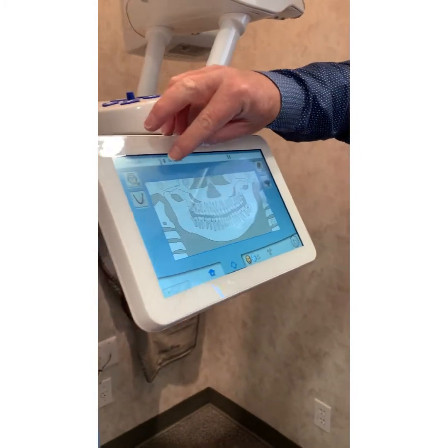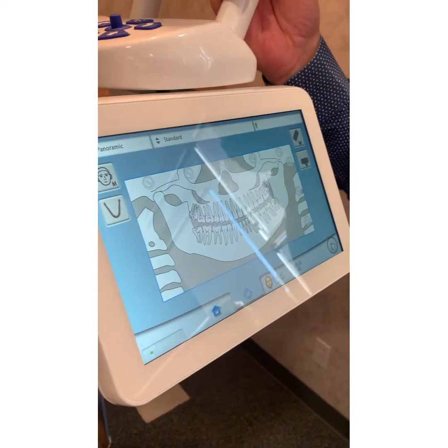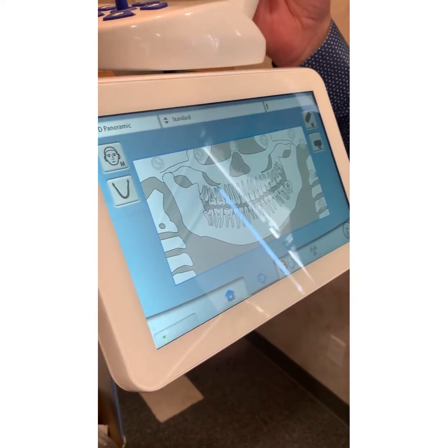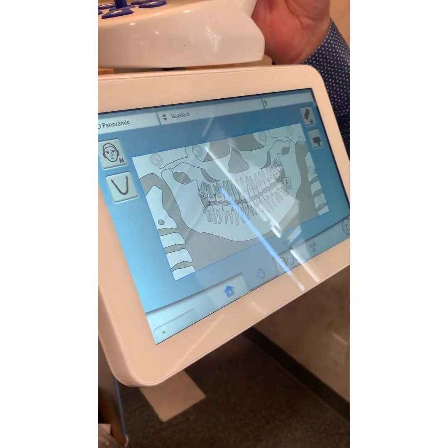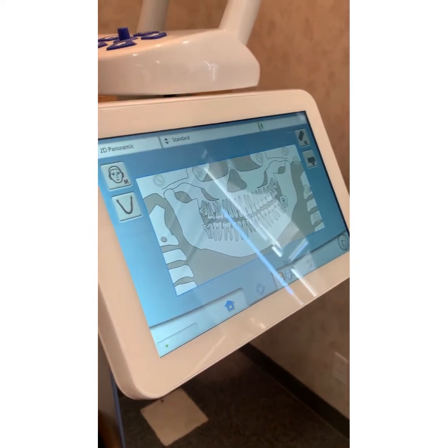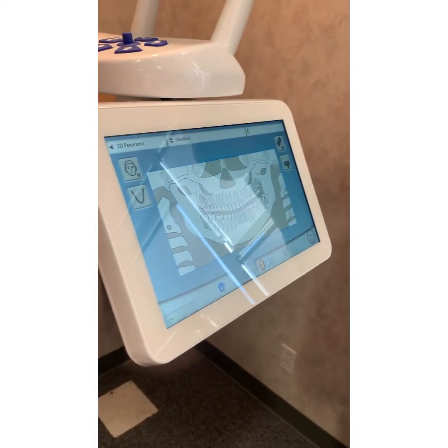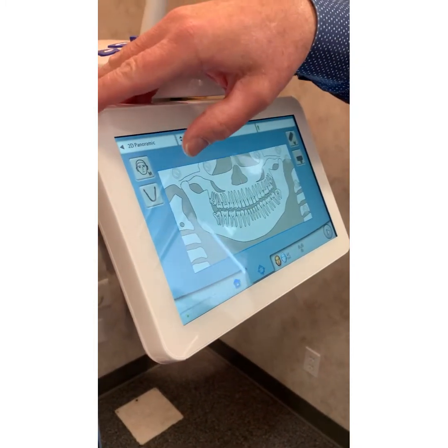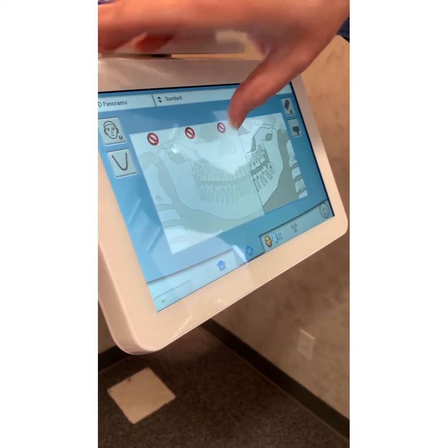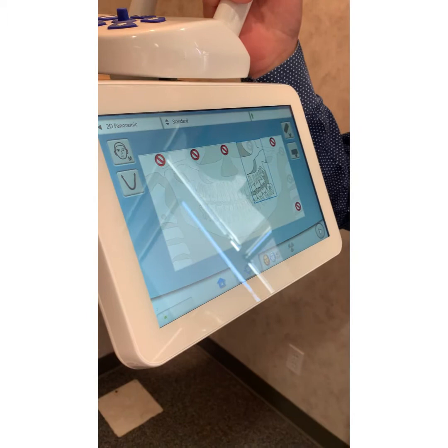Another thing I like to point out on this screen. Back to the old CDA CARES meetings, where we take 530 pans, including pre-screening, in 2.5 days. It's crazy. Right next to us is the PA department, where they have sensors, and there's always 10 rows, 20 deep, with people standing around. Every once in a while, one of your colleagues will come over and say, hey, could I capture a maxillary posterior PA real quick with a ProMax so I can get this person on to the next station?